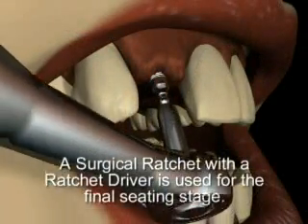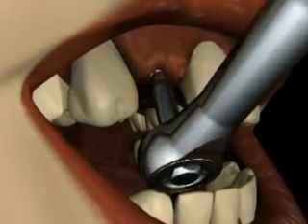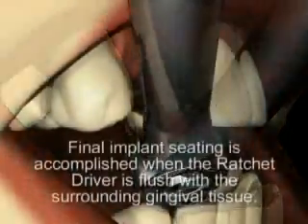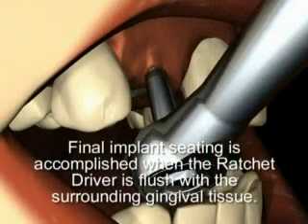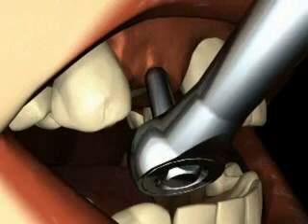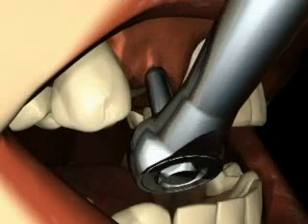A surgical ratchet with a ratchet driver can be used to accomplish the final seating stage. The ratchet driver is also available in a long shaft version for clearance in narrow spaces. Final implant seating is accomplished when the ratchet driver or contra angle driver is flush with the surrounding gingival tissue. At this point the implant is securely in place, the gingival collar is in its proper relationship with the soft tissue, and the o-ball abutment is at its correct height.